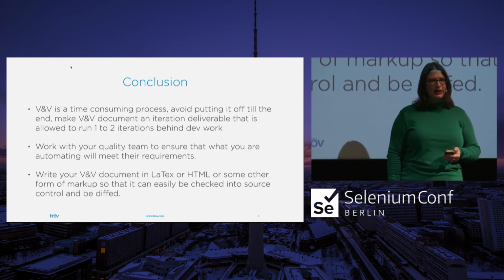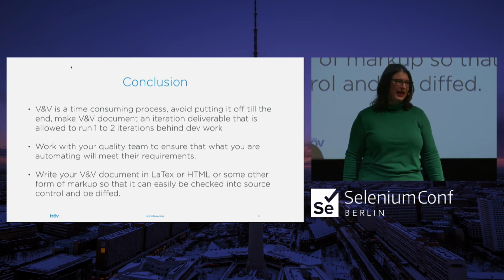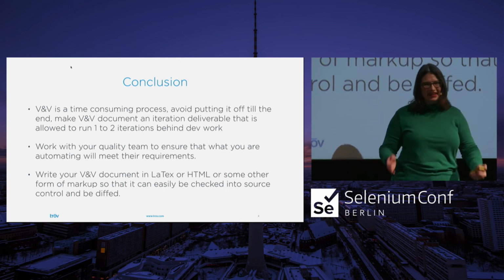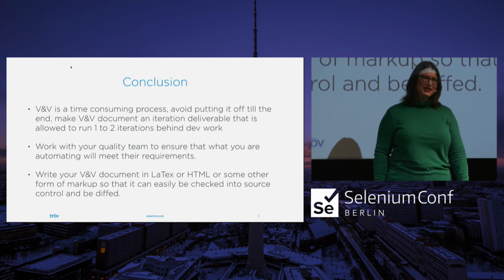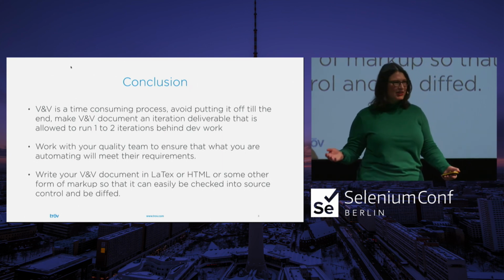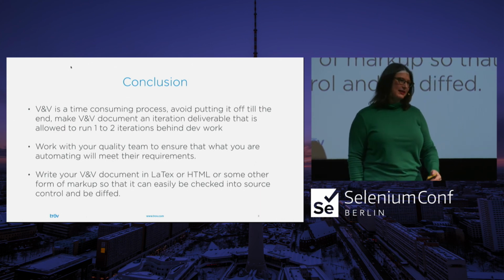So we wrote our V&V document in Word because our customers use Word. This was a terrible idea. Don't ever do that. I would never do that again. I would make everyone learn LaTeX. Why? You can check that into version control. You get an automatic change log. Wait, you need a change log? Every time you change that document, you need a change log. If you get that automatically, sweet.